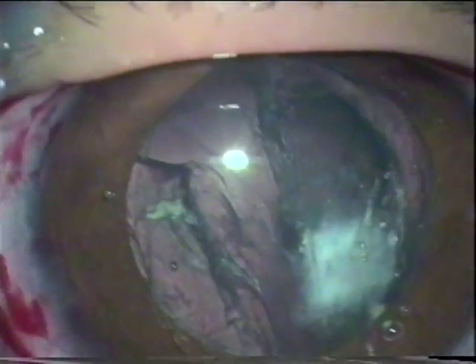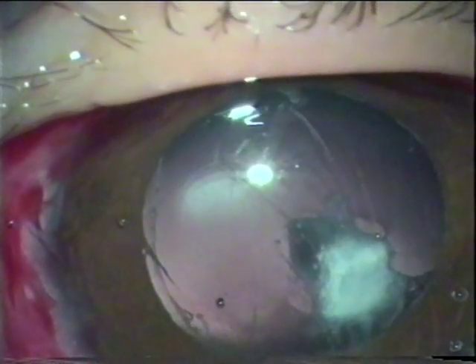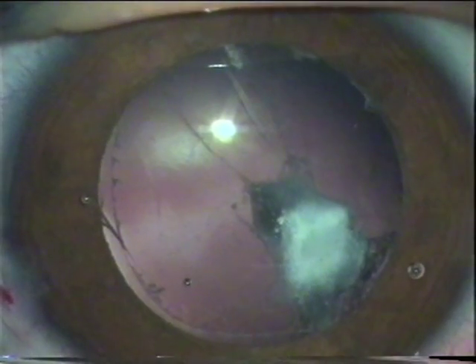Injecting viscoelastic into the capsular bag. Clearing the lens matter. We come across posterior polar opacity attached to a Hyaloid Artery. Something has to be done with it.